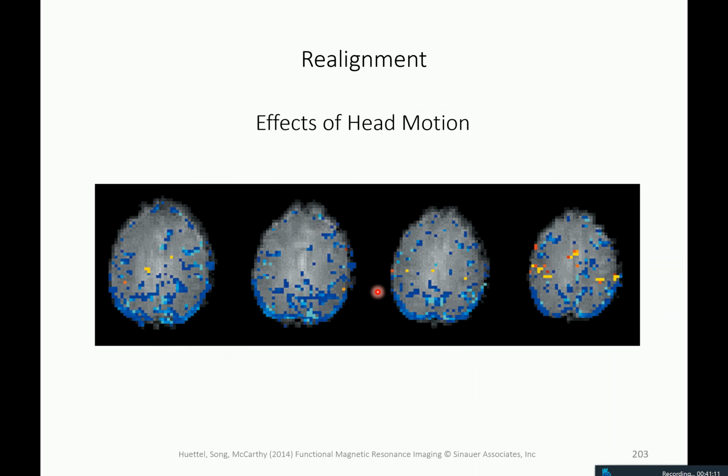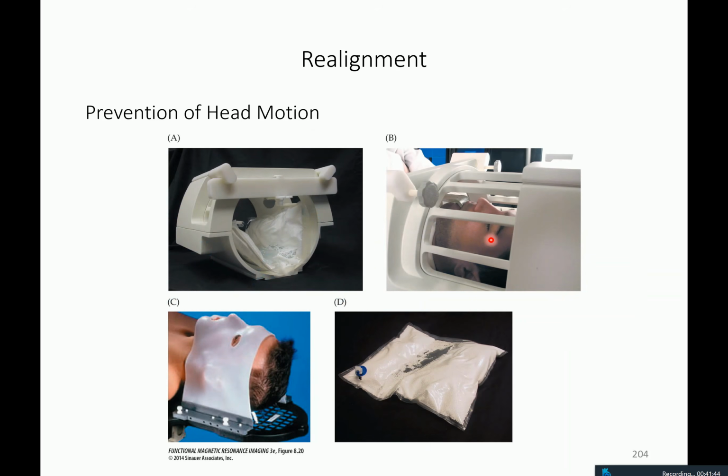The effect of head motion, which you then sometimes pick up using your regressors that pick up variance because they are themselves a variable. You can usually see that the head motion was not fully corrected by getting activations or voxel significances at the edge of the brain, because this is where the motion effects are most pronounced, as the previous slide had shown. So what can you do?